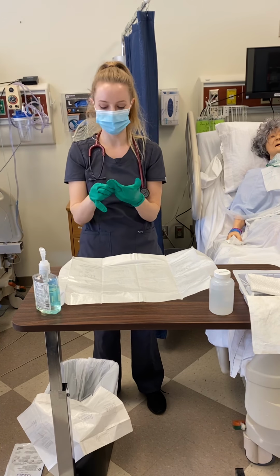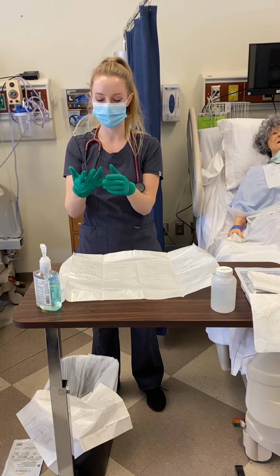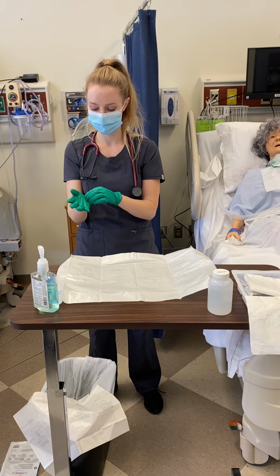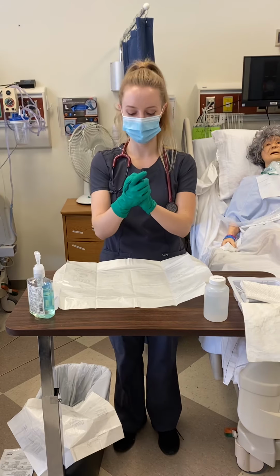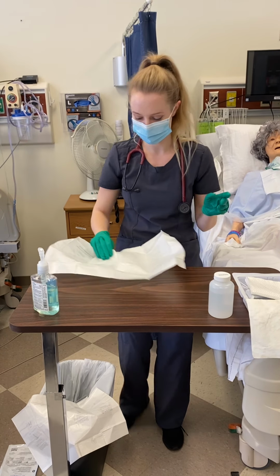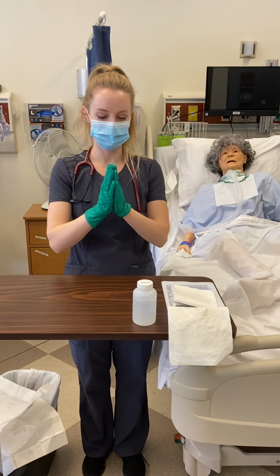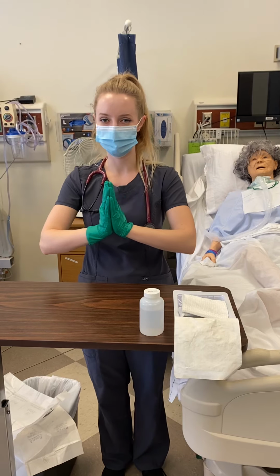And my thumb did touch my glove there a little bit, and that does break sterility. For the sake of this video, I'm just going to keep going. So I would have broken sterility there, but for the sake of this video, we're just going to keep going. I should also not have let my hand drop below my waist as I threw that away.